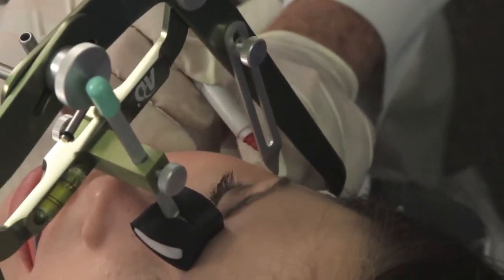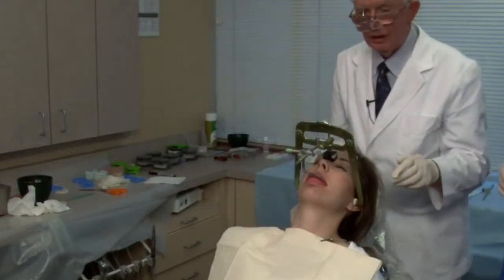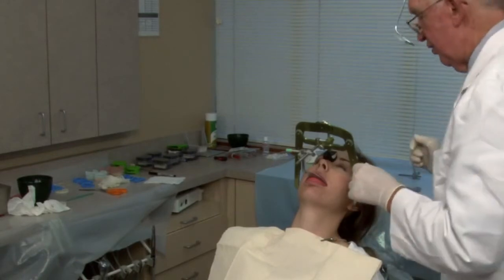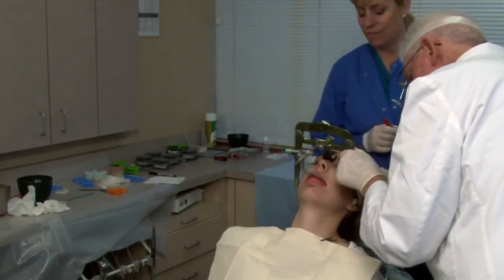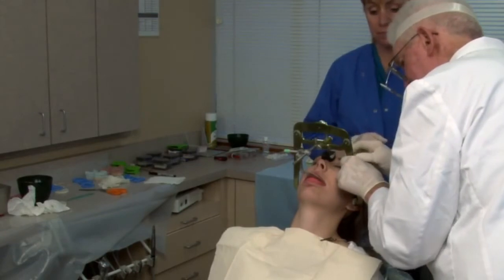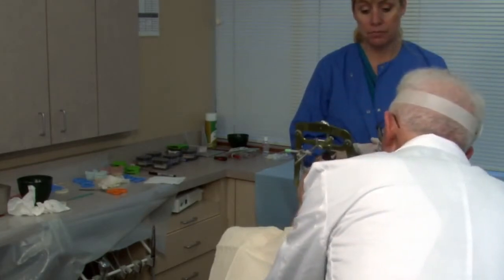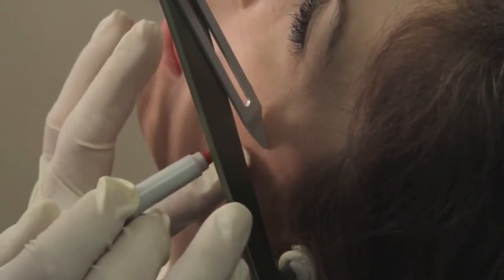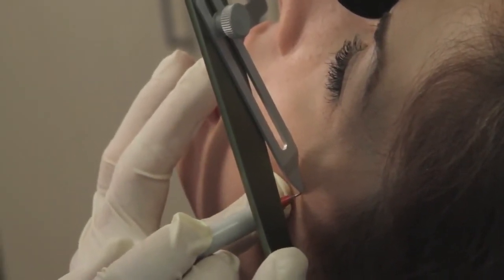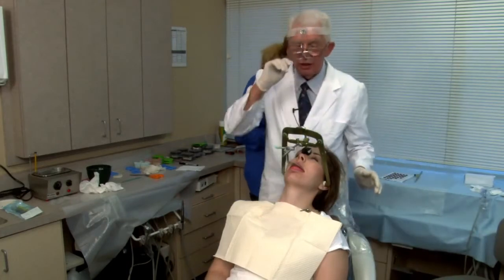Again, reach over, pull the cheek down, put a dot. I'll ask the patient, be sure and do not reach up and touch your face and rub those dots off. You'll see what the dots on the cheeks are for later on when we do our hinge axis.